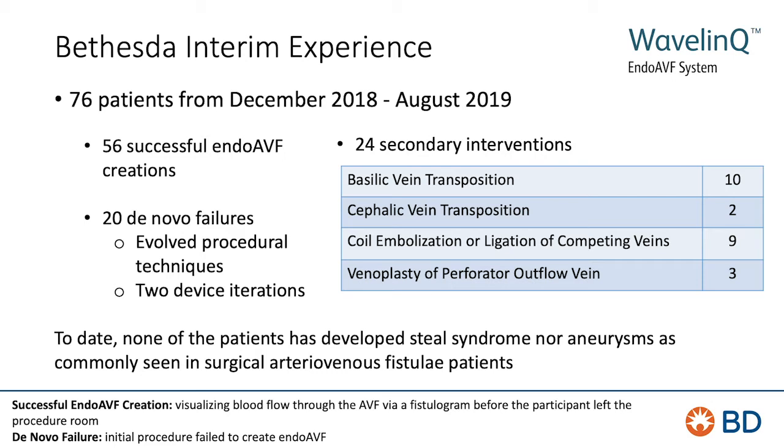We've actually had to do a couple of venoplasties. I think that the one thing that has sustained me more than anything during all of these hiccups in the learning curve are the patients who ultimately achieve 2-needle dialysis with an EndoAVF, and those patients are unbelievably excited because, as you know, a dialysis center is a small social group. All the patients can see everybody else's arm, and the arm of a patient with an EndoAVF doesn't look that much different than a normal arm.